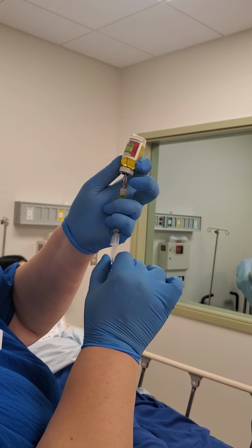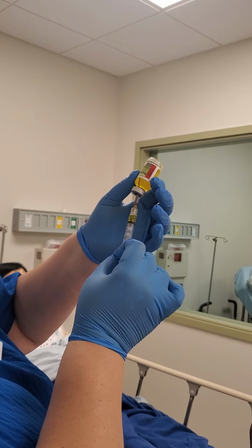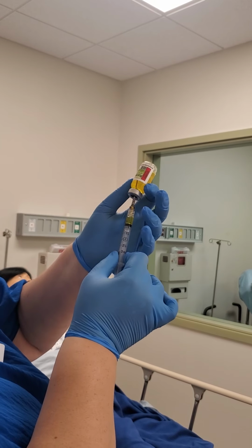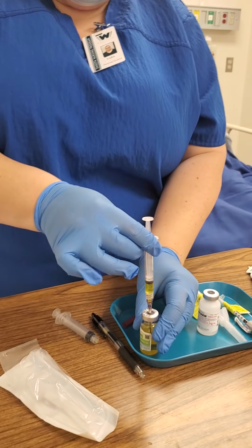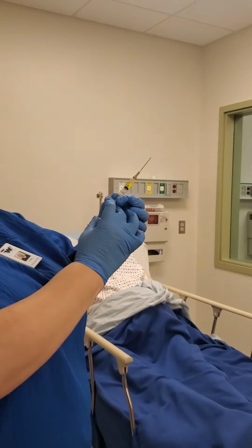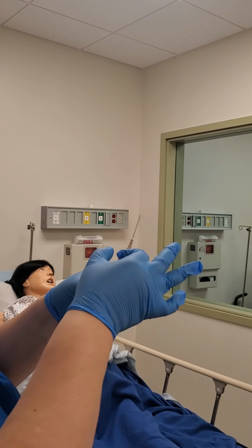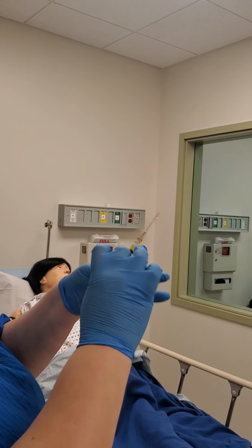And I'm just going to draw a little bit more, so that I know I have enough. Okay.